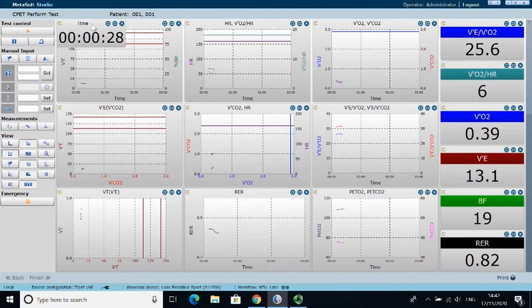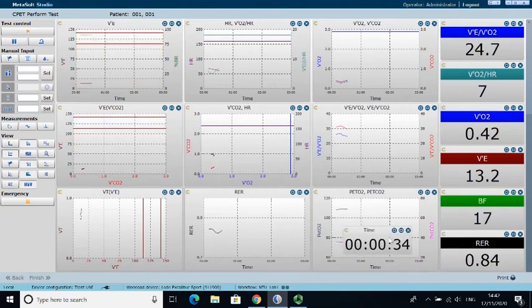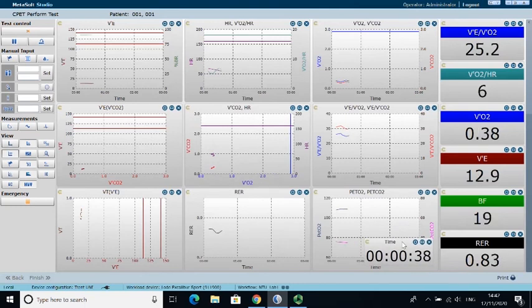And now what I'm doing is I'm going to alter how the screen looks, just to give me a bit of additional information. So what you can see here is I've added on time. Now that's useful obviously for being able to run a test so that you can be telling your participant where they're up to. So in the minute, the first 3 minutes is going to be a resting period, so I'll just be explaining the test to them, telling them that they're going to be doing 3 minutes of rest, 3 minutes of unloaded cycling, and they're going to hit this ramp that seems like a hill that gets steeper and steeper and steeper, and that the expectation is that they go for as long as they possibly can.